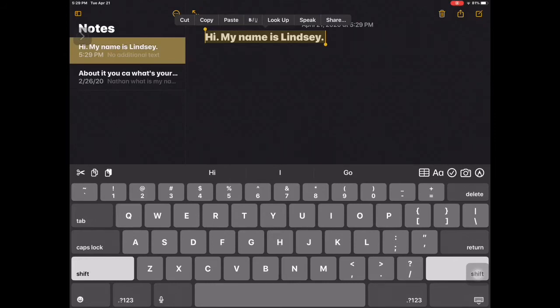But now that speech selection is on, a speak button has been added to this menu, and when it is pressed, the sentence is read.